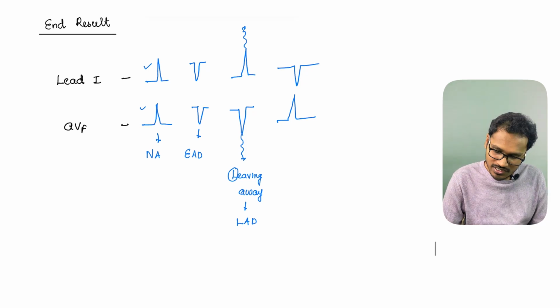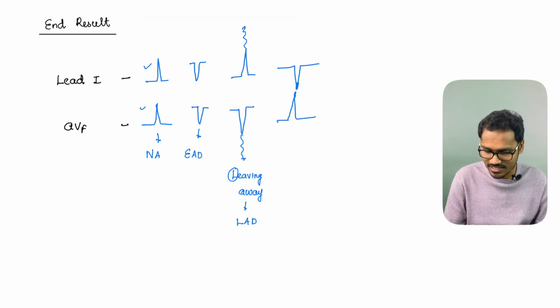Now this couple are close to each other and it looks like they are going to kiss each other. So this is in a right position. They are in the right way to join each other. So right position, you can remember it as right axis deviation.